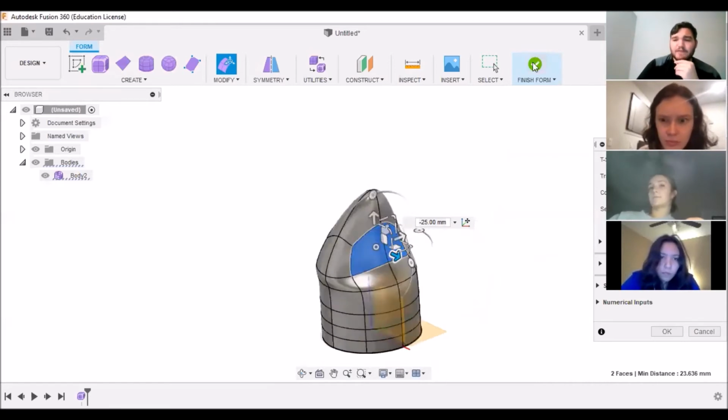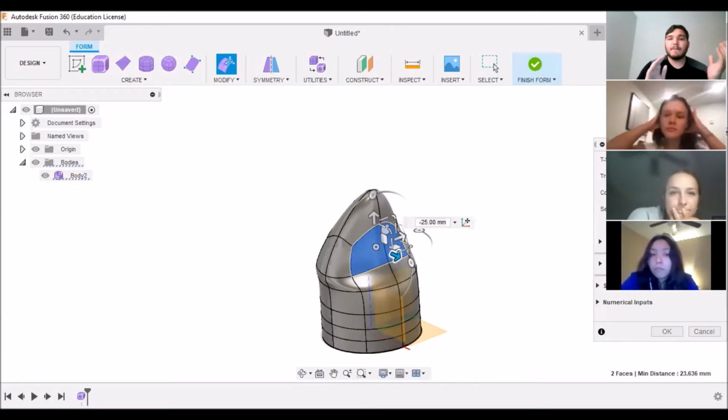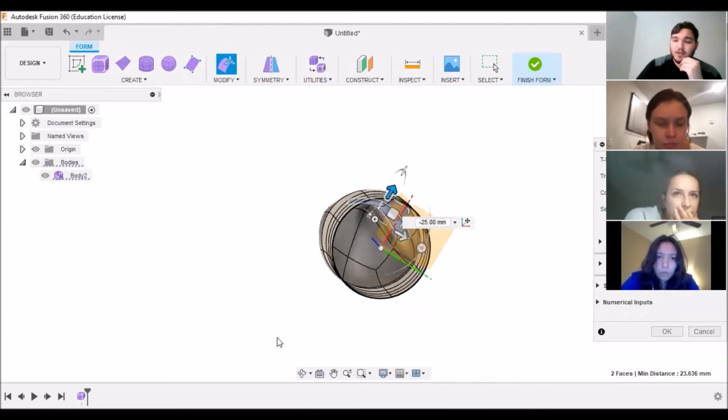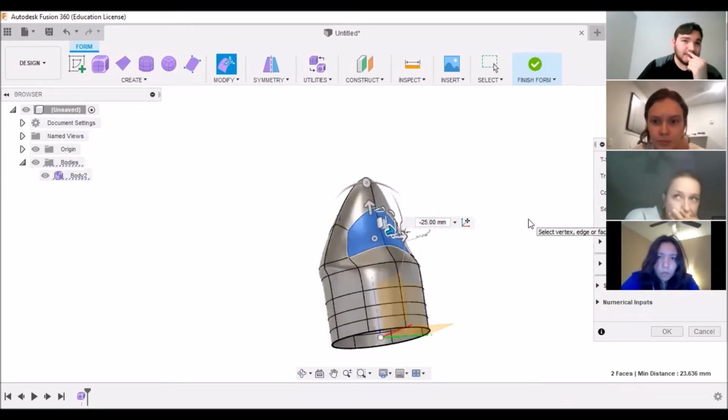So if you were to finish form now, you'd be presented with a wide array of errors, okay? So how many of you are familiar with how 3D printing works? A little bit, yes, no? Okay. So the idea is basically you have surfaces, and from those surfaces you can extrapolate interior volumes, and that's what the 3D printer looks at. And so we don't exactly have a completed surface because we have this hole right here. So our surface in form looks fine, but we assume that it's infinitesimally thin and not an exact shape.